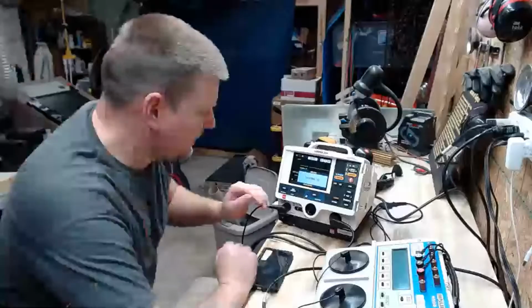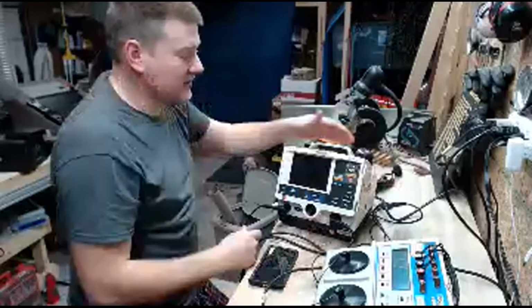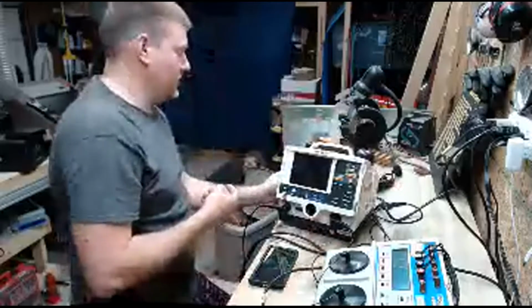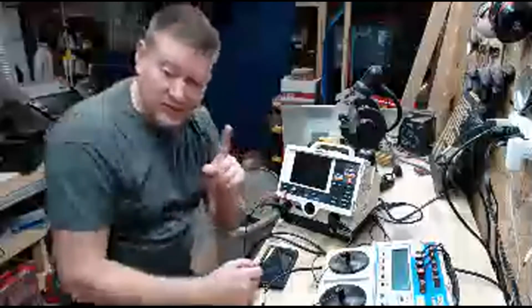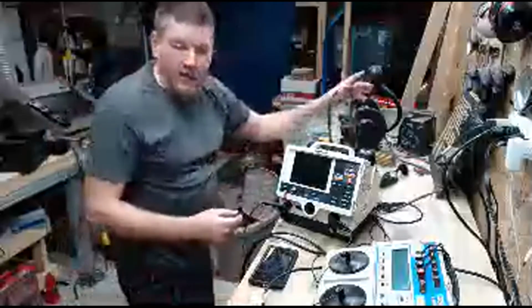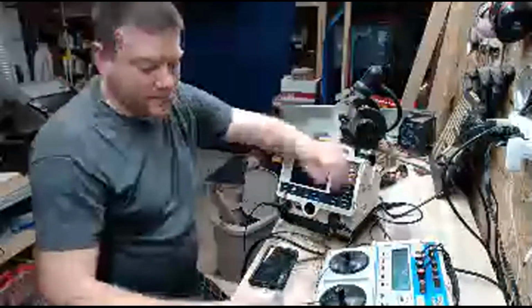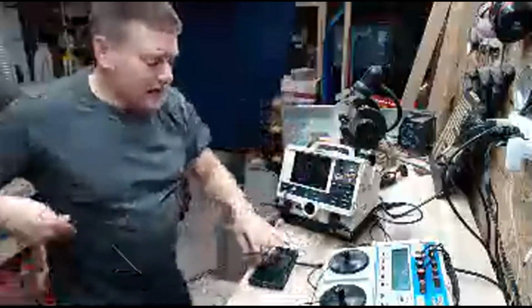All right, guys. So that is the defib in a nutshell. One of them is the cabling all set up neat. That's an item on my checklist. Is the printer door closed? So that's an item on my checklist. Is the defib plugged in and plugged into a red outlet? That is an item on my checklist. And you can tell there's a lot of cabling to stow.